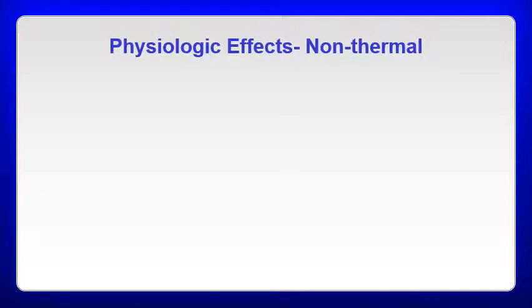So obviously, the heating effects we'll go over with ultrasound, but this is what I was getting at with the non-thermal. Again, if you want to utilize ultrasound for the mechanical effects only, you would select pulsed and then select your other parameters based off that. So you would select a duty cycle that induces a pulse into the sound wave that would turn it off for part of the treatment.